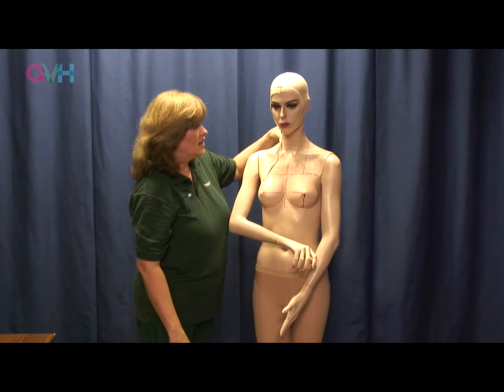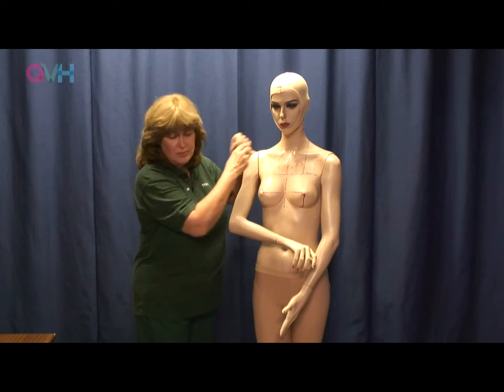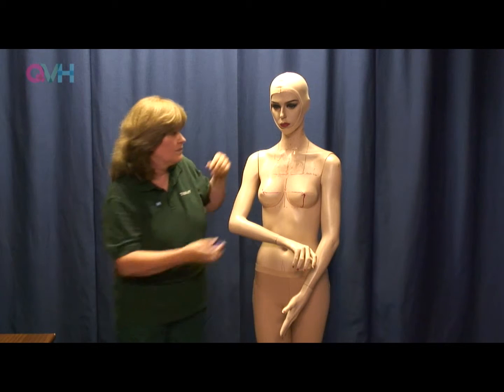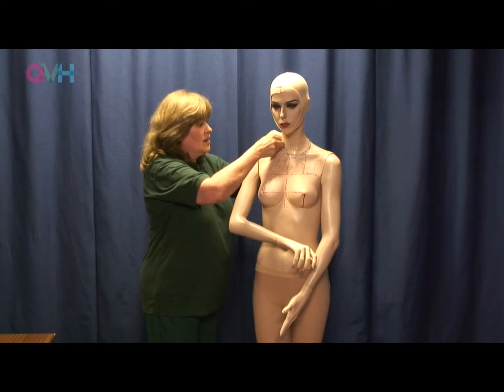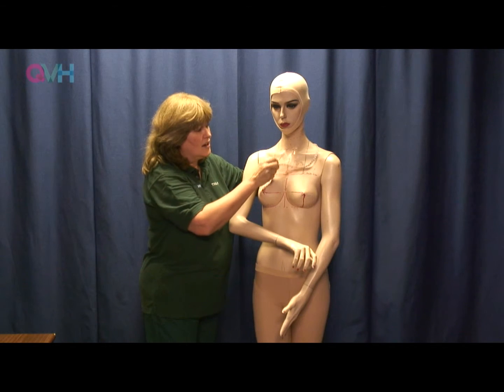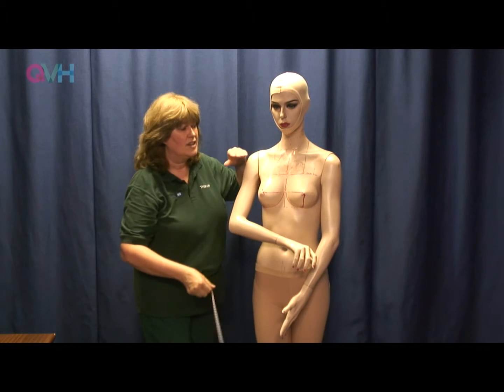I just find that that's the easiest way to explain it. When you're measuring, you're not bringing the tape measure right down on the collarbone, because if you do, we'll end up with a neckline that stretches as the garment is under tension, far too far down.